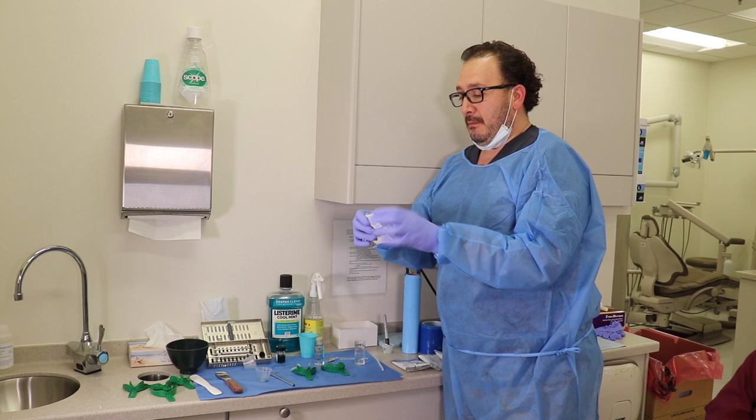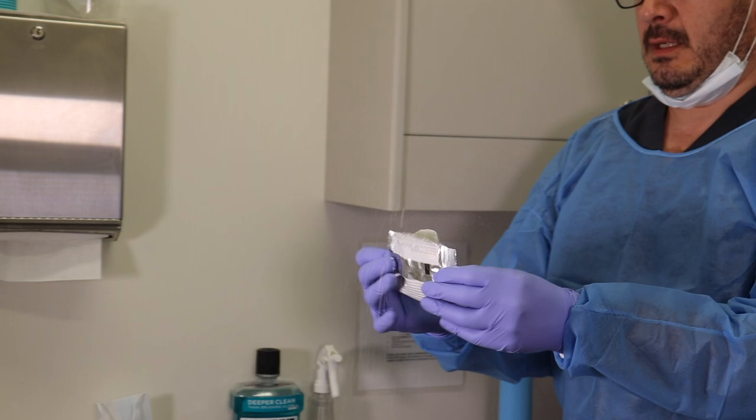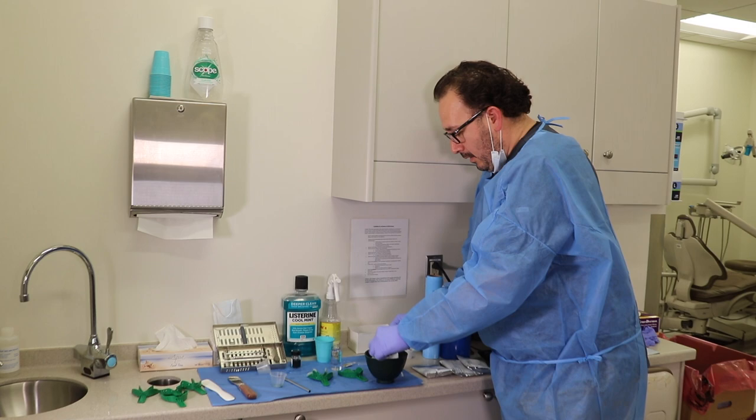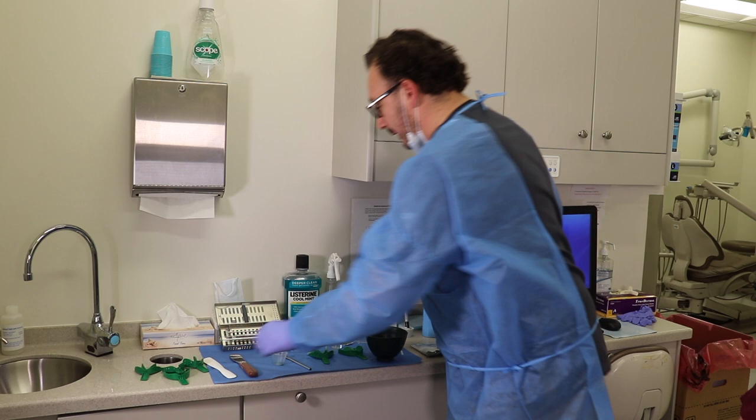When you're opening this, it's very important, as we open the pouch, we don't want powder coming out. You see the powder? This powder, I just did on purpose right now. But these particles can be inhaled, and this stays in the patient's or in your lungs, and it's not safe to do that. So we open it up, pour it in there. Please use masks as you're doing this process. I'm not using the mask right now because, you know, I need to talk.